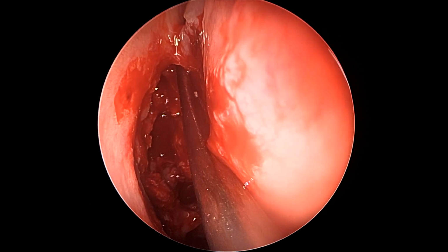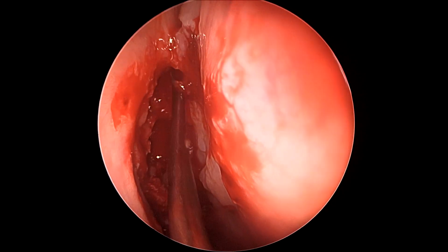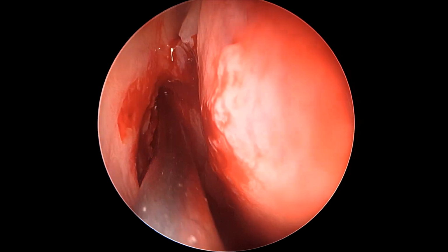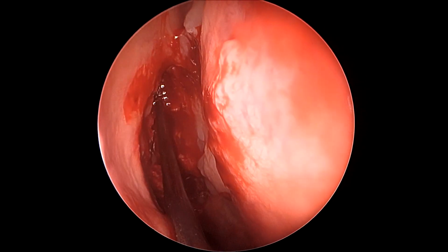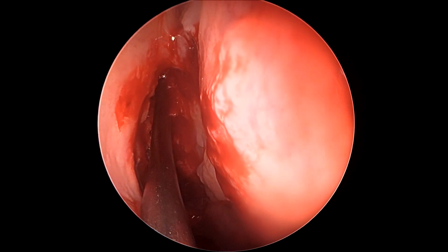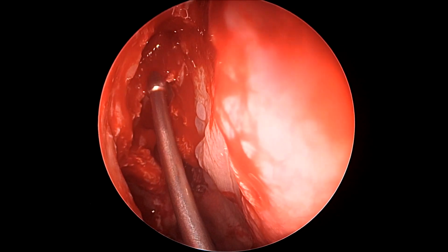Now, once we have located our trajectory, we can simply use our forceps to fracture these cells anteriorly, and we have no fear of the skull base anteriorly, because the skull base lies posteriorly to the frontal sinus. And as we clear more and more bone using a frontal sinus curette or a suction curette, we are able to enlarge our entry inside the frontal sinus. That's important for clearing disease as well as for post-operative irrigation. Now one can start seeing the frontal recess much more clearly.